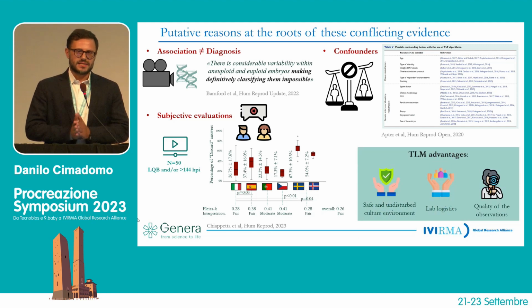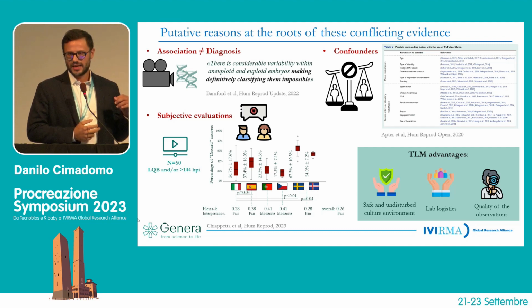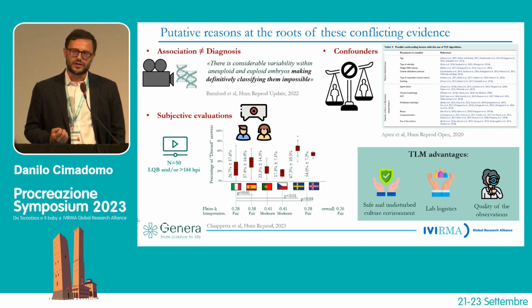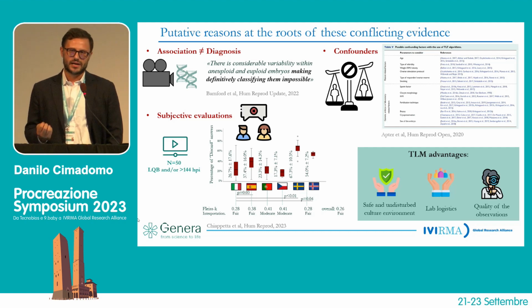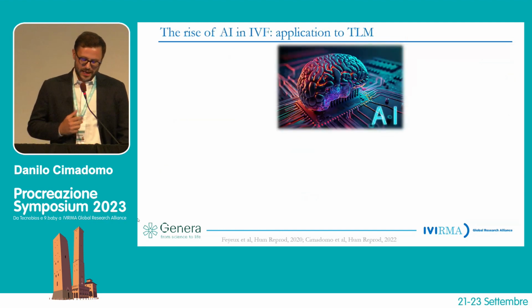Still, time-lapse has some advantages. That's the reason we keep trying to find its true pros in our clinical approach. It is a safe and undisturbed culture environment. Lab logistics can benefit from it. And obviously the quality of the observations. If you do science like our group is doing in pretty much all the clinics, we need this kind of data.